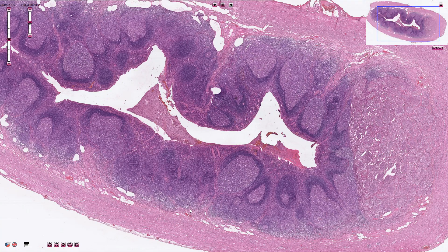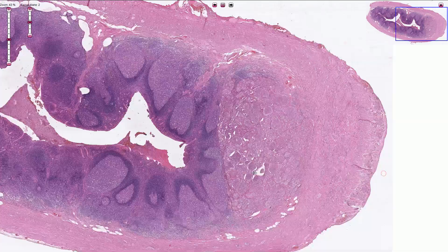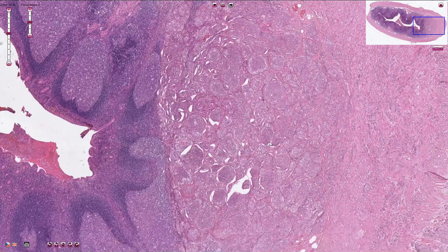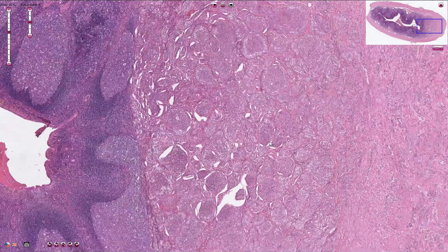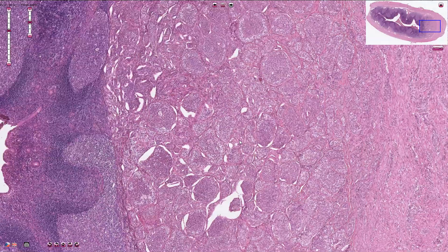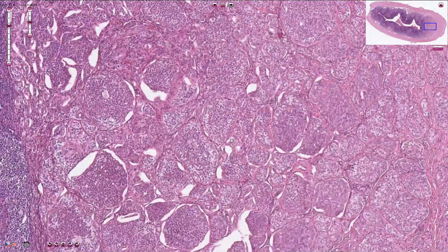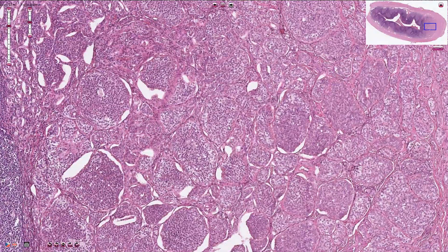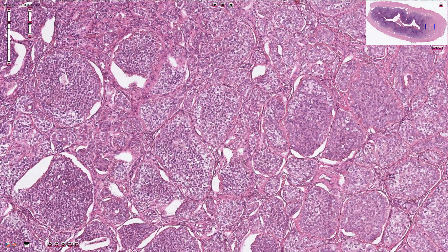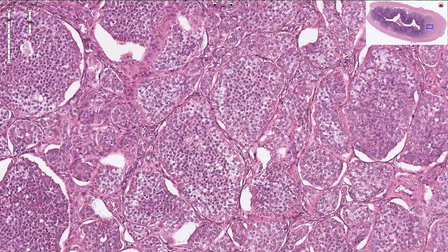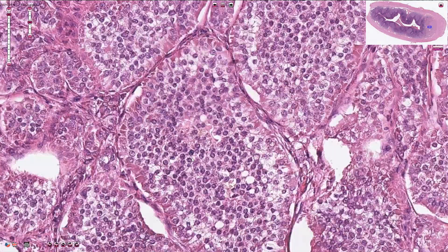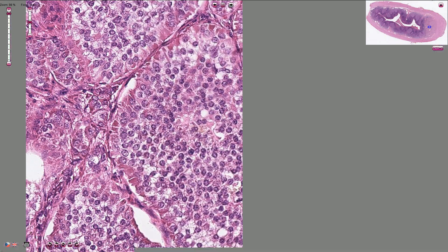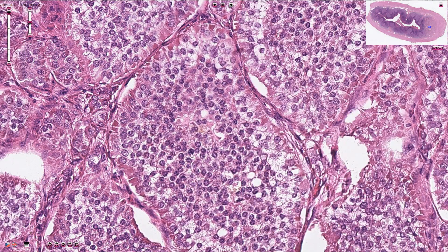Here we see the submucosa and the muscularis propria and serosa. The neuroendocrine tumor is composed of solid nests, and on higher magnification we can see uniform cells with round nuclei.